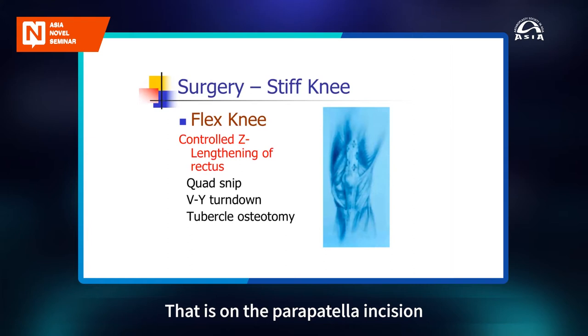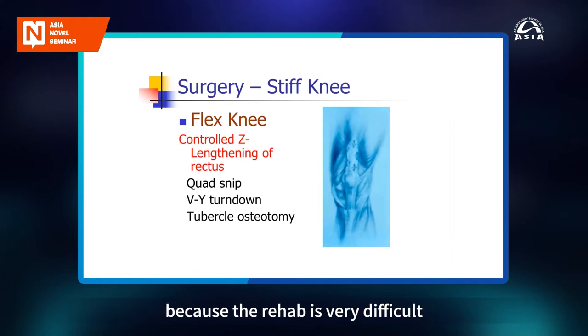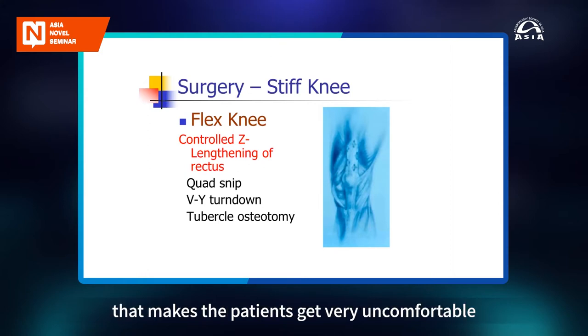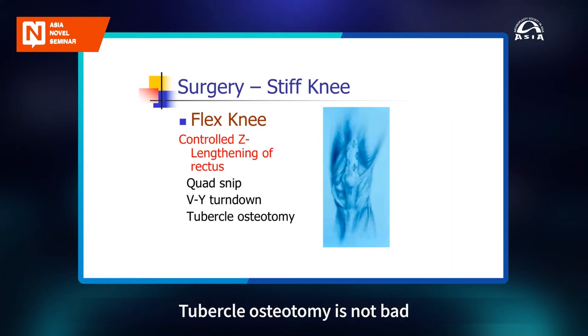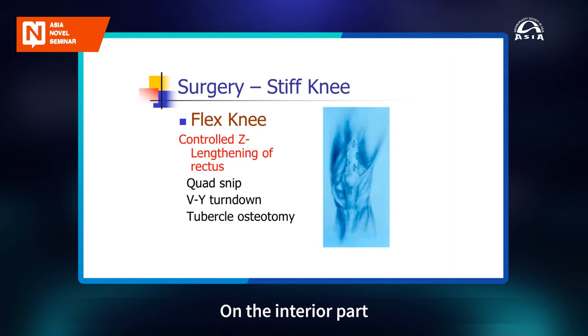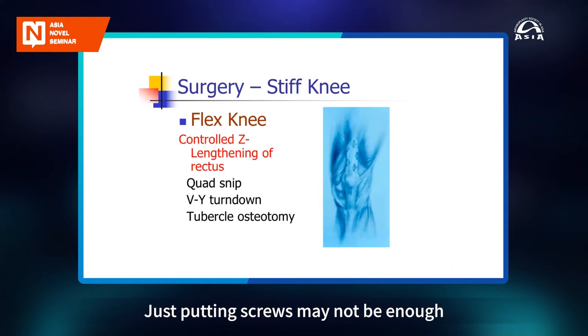That is, on the parapatellar incision, you go up at the end laterally. The VY turn down is really not the best thing because the rehab is very difficult. And in the rehab, you end up with an extensor lag. That makes the patient's gait very uncomfortable. Tubercle osteotomy is not bad, provided performed properly. And it is a big chunk of bone, almost 7.5 to 8 centimeters long osteotomy on the anterior part, taking the tubercle and then rewiring it back. Just putting screws may not be enough after doing an osteotomy.